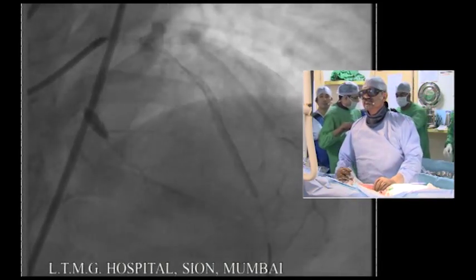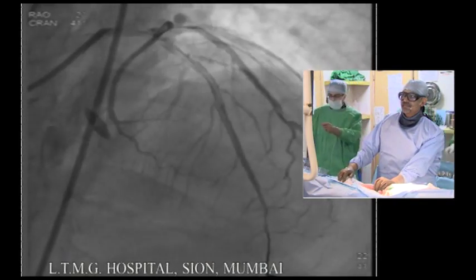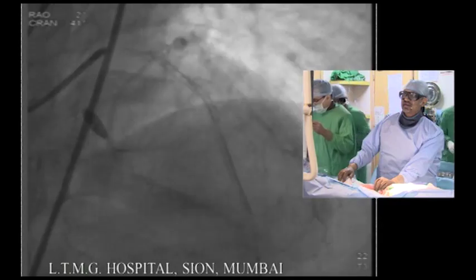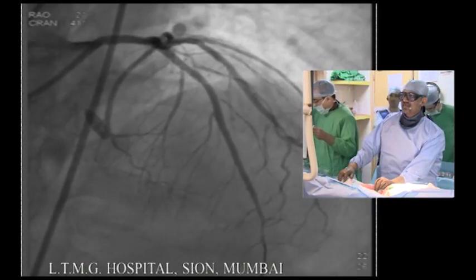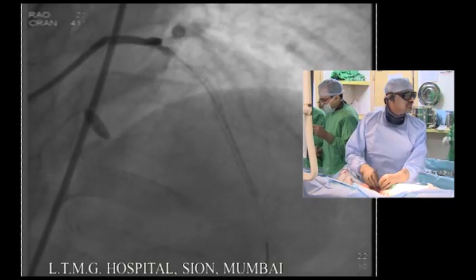Yeah, that's too small distally. You're planning to do any OCT? So this is the result. So now we'll just do the IVUS, do the OCT, and then we'll go for post dilatation. Okay.